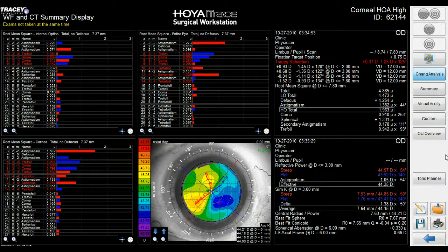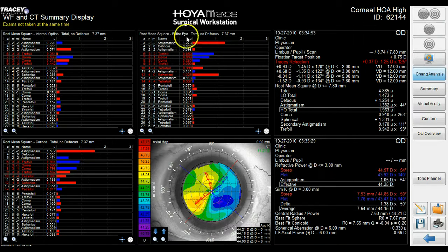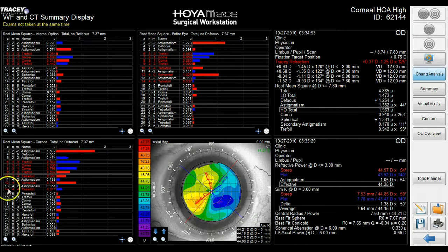To analyze the corneal optical quality, we view the Chang analysis. This display, specified by Dr. David Chang, separates the corneal wavefront from the internal optics wavefront, quantifying the source of the aberrations. It provides color coding to highlight those aberrations that are beyond the norm. In this case, we see that the patient presents with a high amount of corneal higher-order aberrations. The patient is not going to be happy with a premium lens unless this corneal issue is resolved.